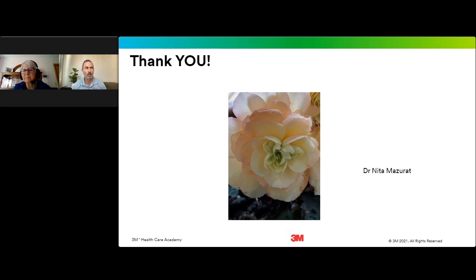And the other thing I also wanted to point out when it comes to time, and you shed light on this, was the point of use. If you're pre-treating your instruments, if there's blood and saliva and other type of gunk on there, so to speak, it really helps protect those instruments, because when you get them to the cleaning phase, it's already started the process. You're not going to be at the sink scrubbing away, trying to get blood and other debris off. Yeah. Chipping at it, or breaking other instruments, trying to get it off.